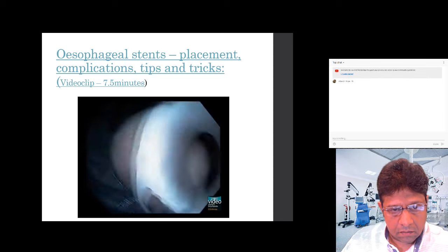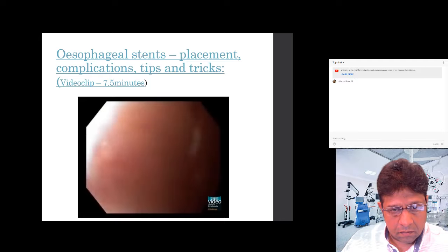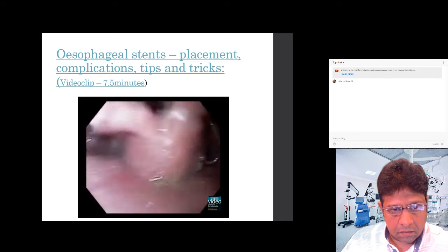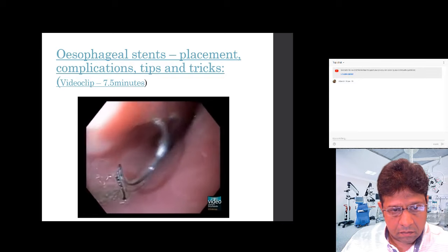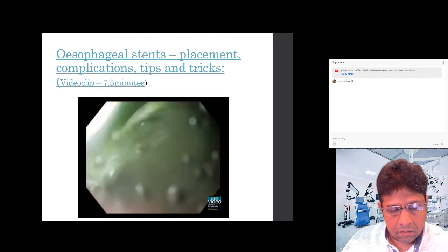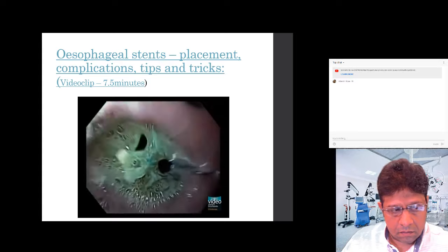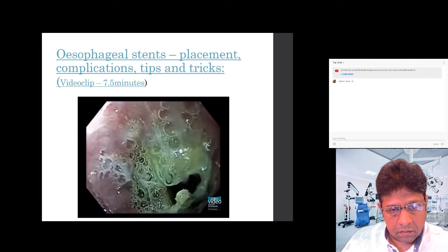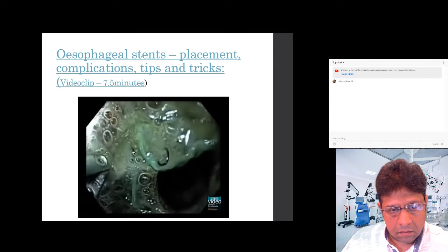The stent is located just below the level of the upper esophageal sphincter. The endoscope passes into the proximal esophagus. The stent is grasped, again with the rat tooth forceps, by the retrieval string and removed from the patient. Other complications, including tumour ingrowth and overgrowth, can be treated by stent within stent placement. Perforations are rare, but can often be managed by other stent placements.